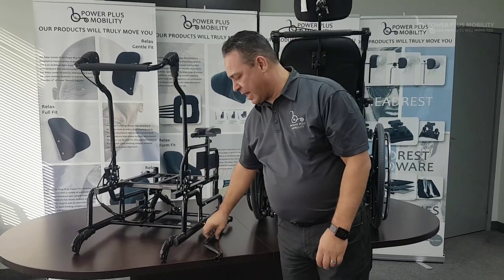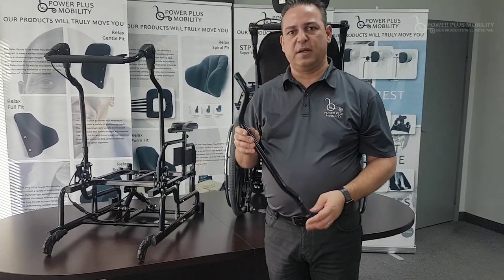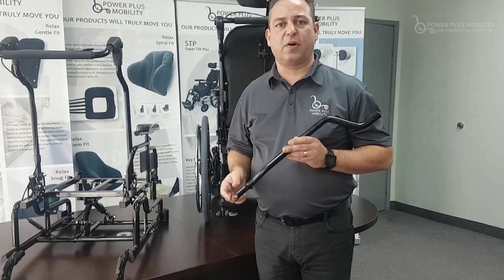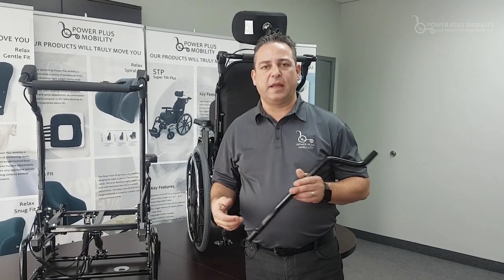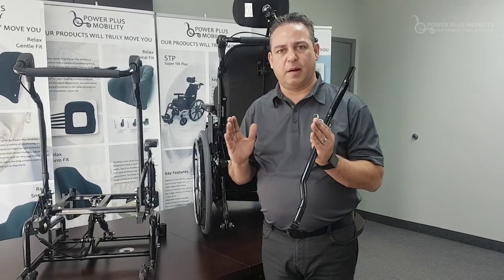Another type of back cane that we have is what we call the endomorph back cane. There are a number of different shape clients out on the market. Take for example somebody who's pear shaped and they need a 20-inch wide chair below but an 18-inch back above.